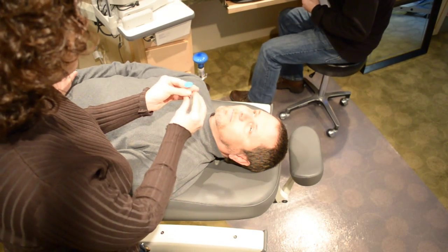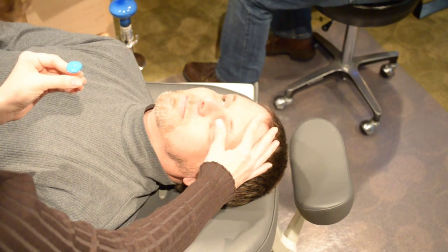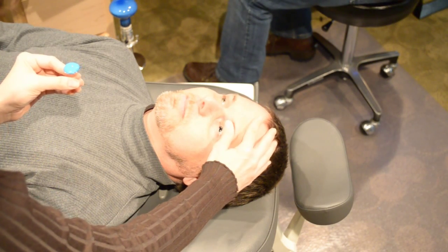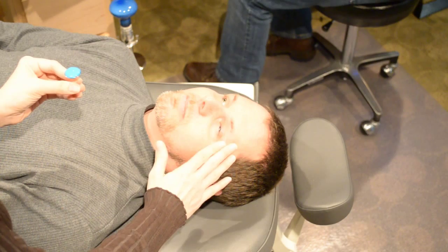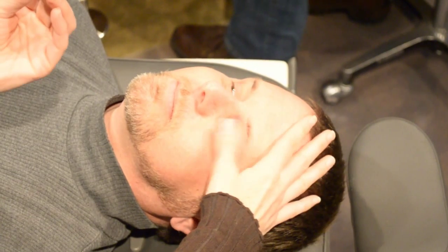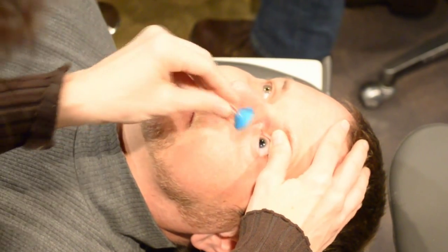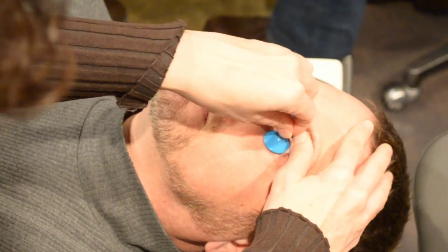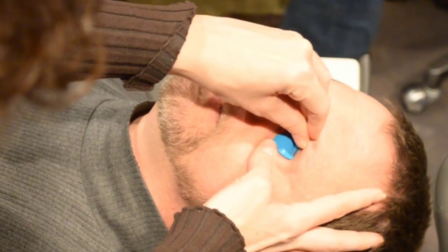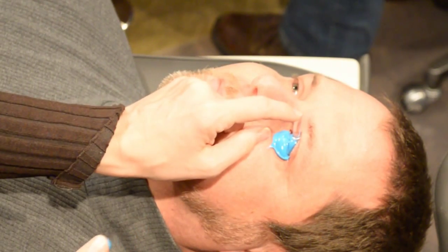I want you to look straight ahead, right up at the ceiling. I'm going to be touching your upper eyelid and holding your eyelid open. Once it's in, I'm going to let go of your eyelids and you can blink as you feel comfortable. Go ahead and look down at the ground. Just look straight ahead — that spot at the ceiling.